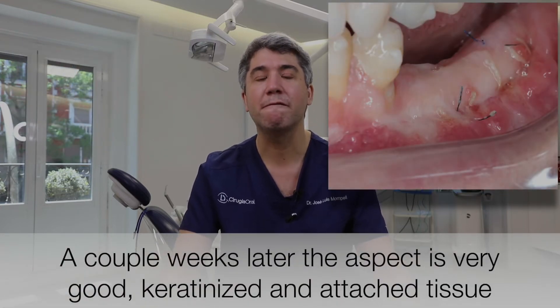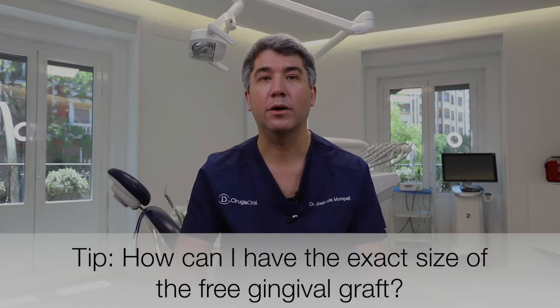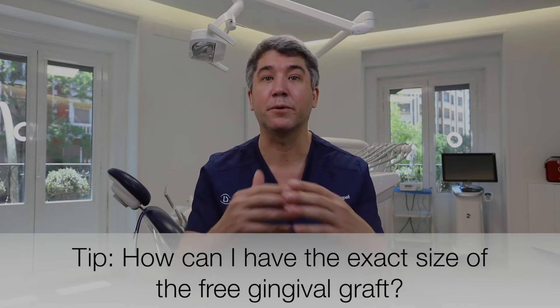We want to share with you five tips that will make your clinical practice easier, faster, and give you more predictable surgeries when doing free gingival grafts. The first tip is about how to prepare our graft. The first thing is to prepare the recipient site — we're going to make our incisions in the mucogingival junction and prepare our periosteal base. That periosteum will be the one in charge of vascularizing our graft. But the first tip is related to how large a graft we are going to harvest.